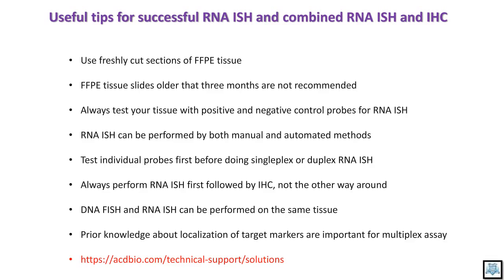The other important point is, if you are doing both IHC and RNA-ISH, make sure you do the RNA-ISH first, then do the IHC, not the other way around. And as I mentioned before, the DNA FISH and the RNA FISH can be performed on the same tissue as long as your targets are distinct.